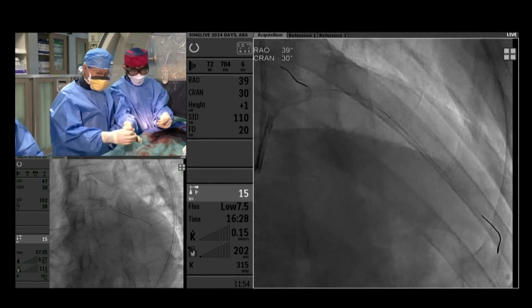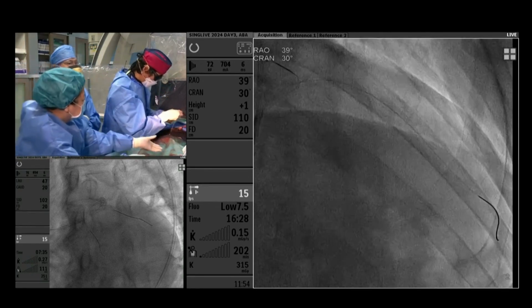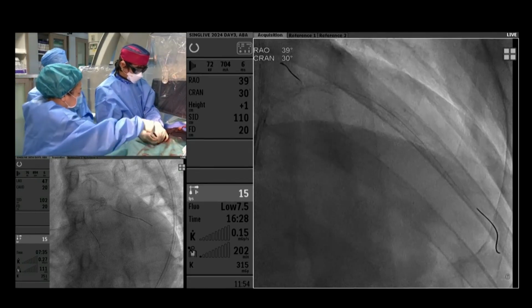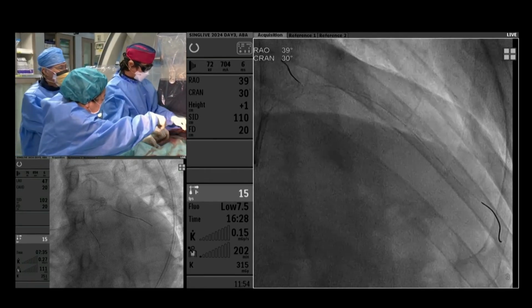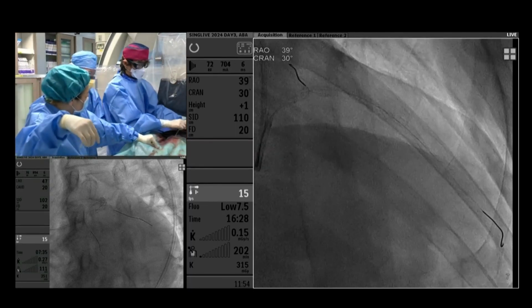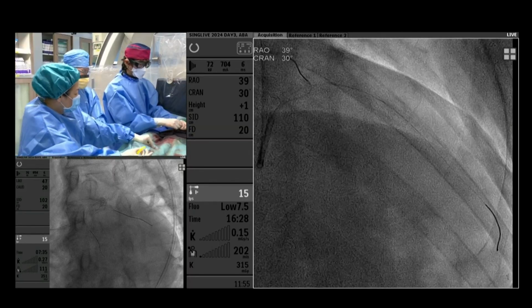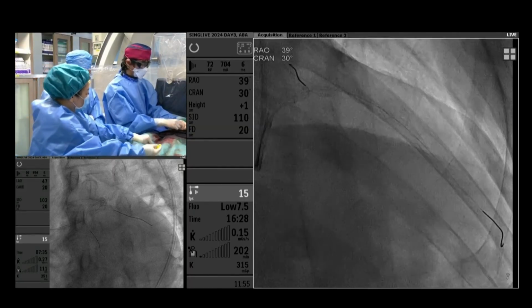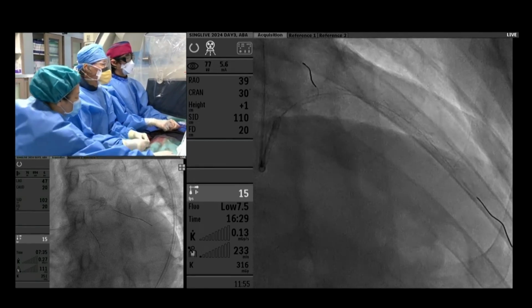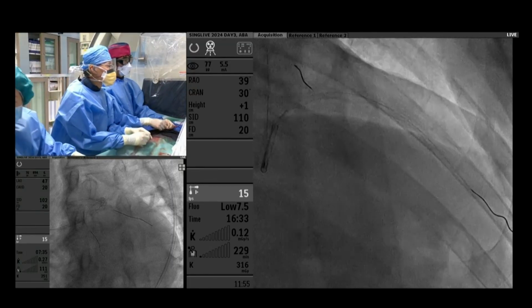So, Prof, with that picture, I think we'll come soon to the end of the transmission. But we really want to see the pictures. But while waiting for the catheter to go in, I must say this is a really elegant demonstration of complex PCI. With how much now, you've only used 5 cc's of contrast. You've got to at least make it a double digit, but it looks tremendously amazing. Let's see the angio results.